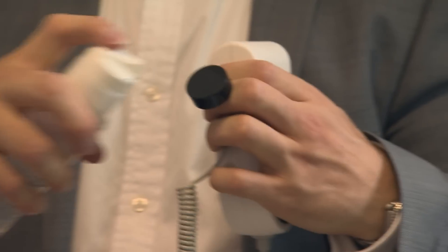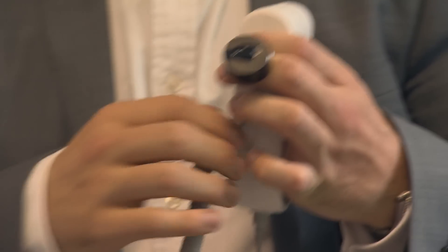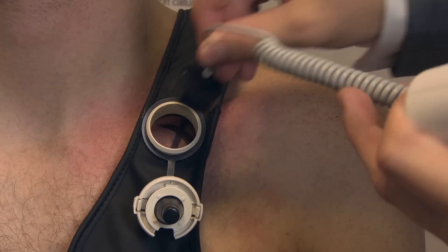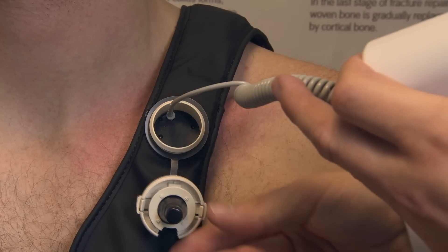I'm now going to put a pea-sized blob on the end of the transducer. Place it in the hole, like so. You should feel a slight cold sensation.